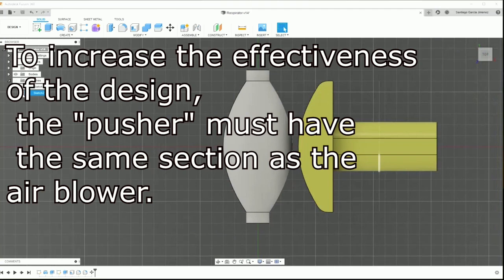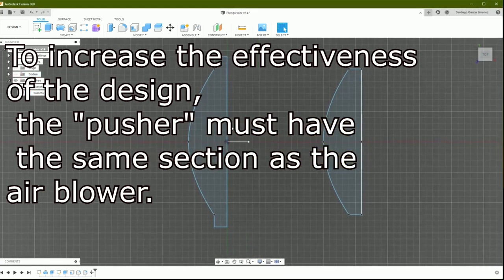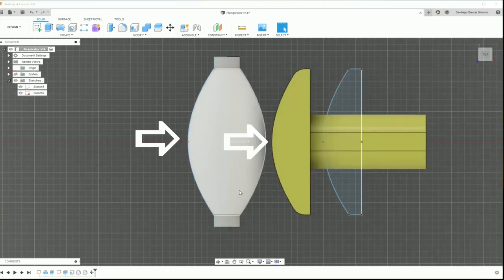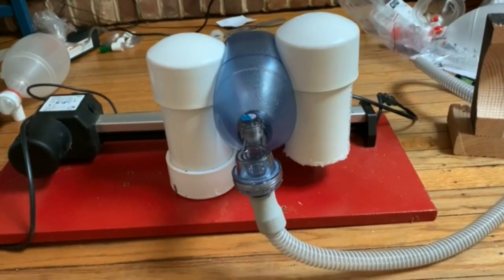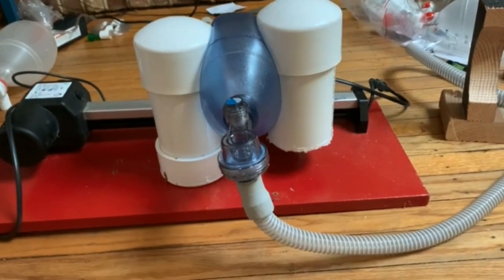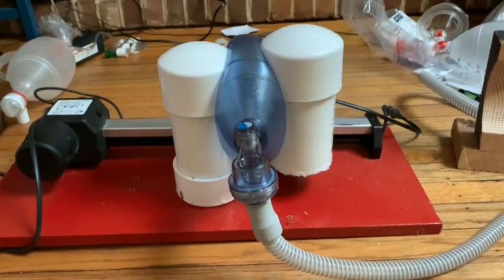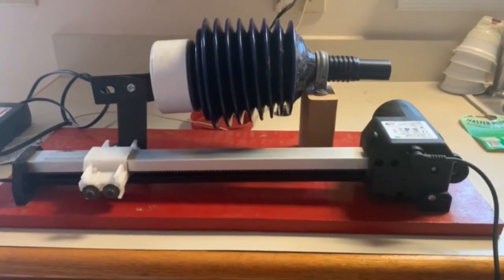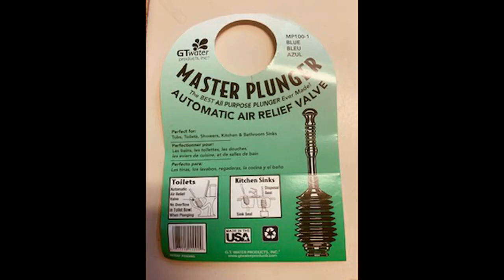I posted this problem on the MIT chat site and one of you responded by sending me this optimal compression computer simulation. This led to the first improvement of design which allowed the Ambu bag to tether freely and be compressed by three inch PVC piping. If Ambu bags become scarce, a bellows can also be used using this design.